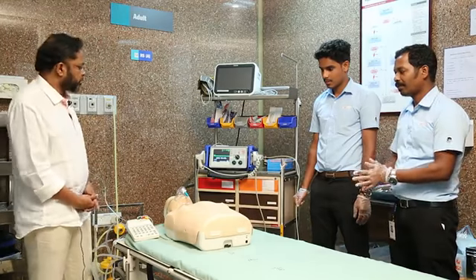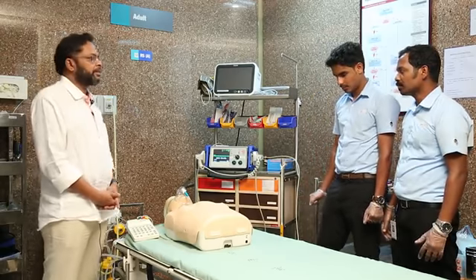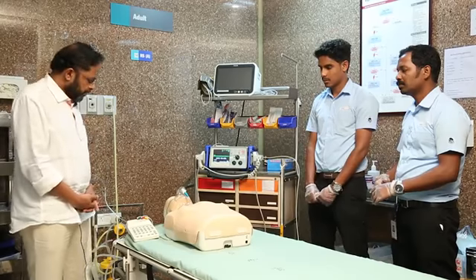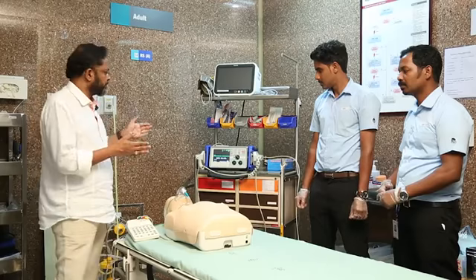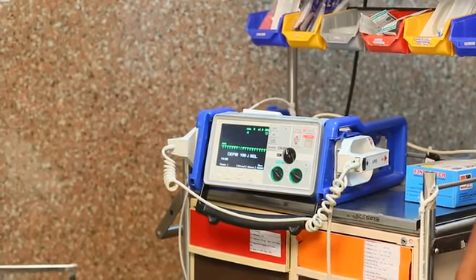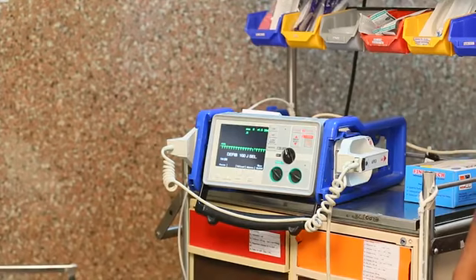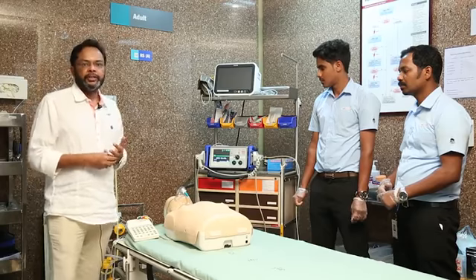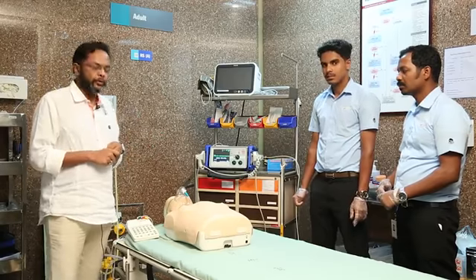Cardioversion is another procedure that is usually done in the emergency room, even in theatre, ICUs and coronary care units. A patient comes with a fast rhythm, which can be either supraventricular or ventricular. Irrespective of this, a fast rhythm with signs of instability like giddiness, altered mental status, diaphoresis, high pulse, hypotension, or syncope is an absolute indication to do a cardioversion.